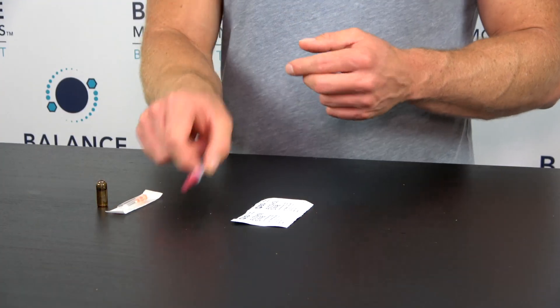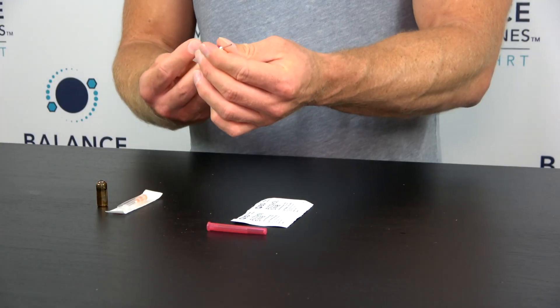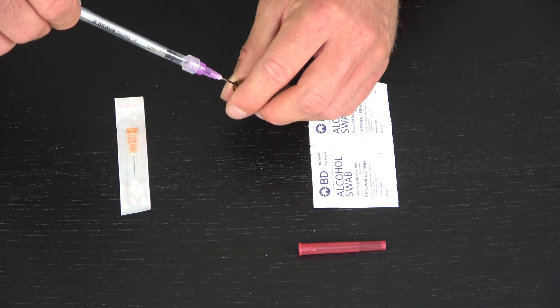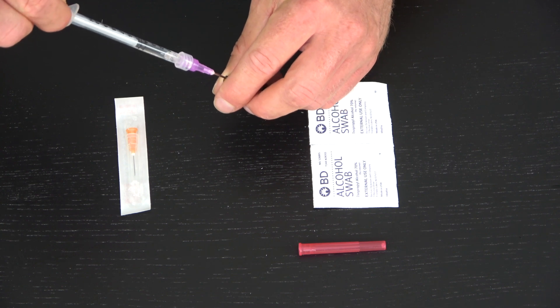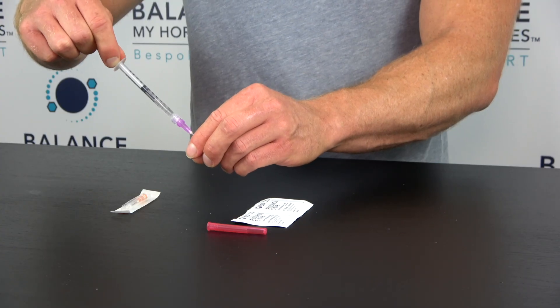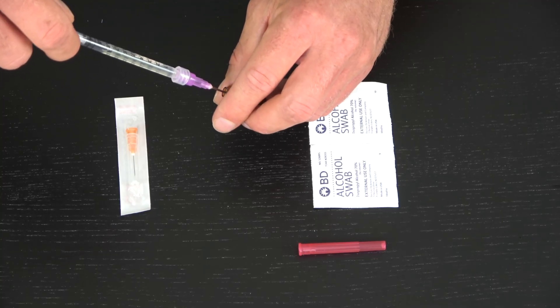I'm going to draw up 0.8 mL. You obviously work out your dosage from whatever the doctor prescribes you. We're going to draw up the liquid from the ampoule — going all the way up to your dosage, so I'm going to do 0.8 here.